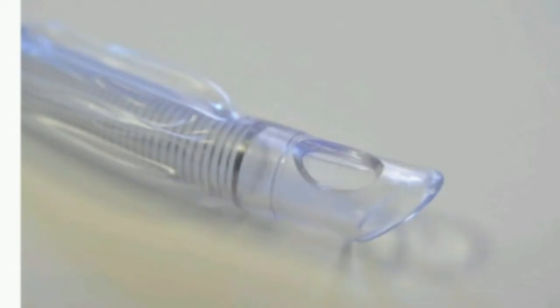Just like standard ET tubes, armored or reinforced tubes have the typical left-facing bevel at the tip and the Murphy eye. Their distinct feature is a metal wire coil embedded in the wall of the tube shaft which keeps the lumen of the tube open when it is bent.